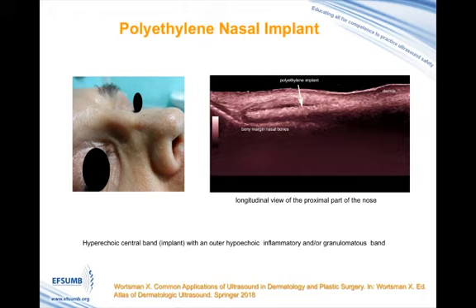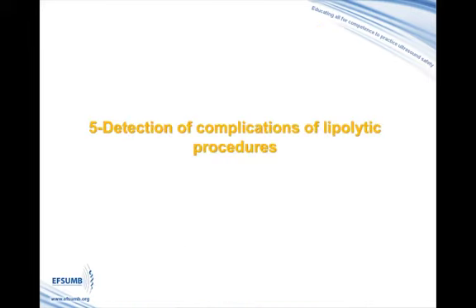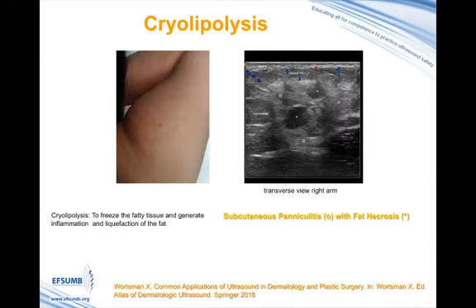The fifth indication is the detection of complications of lipolytic procedures. Among the lipolytic procedures is the cryolipolysis. The principle of cryolipolysis is to freeze the fatty tissue in order to generate inflammation and liquefaction of the fat.